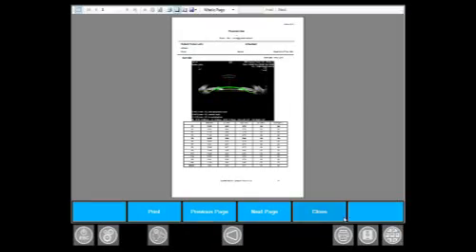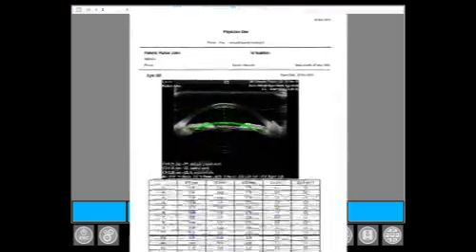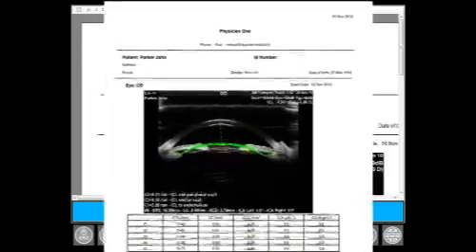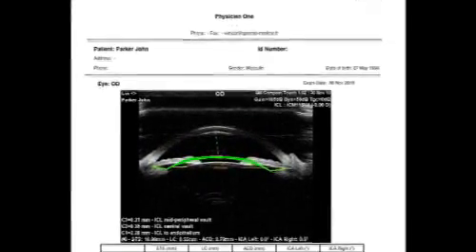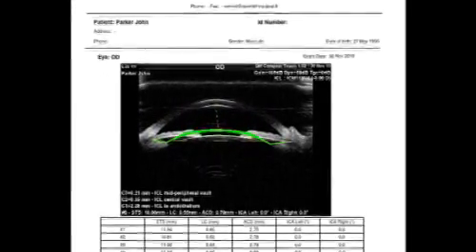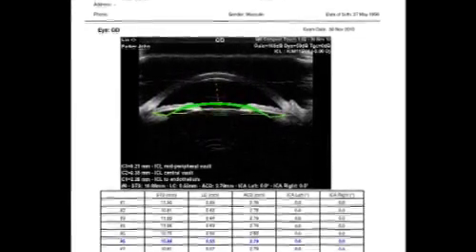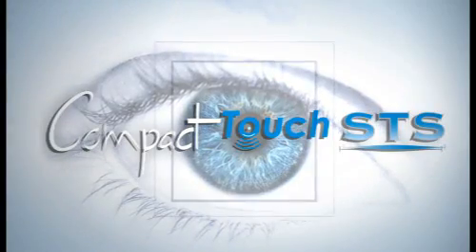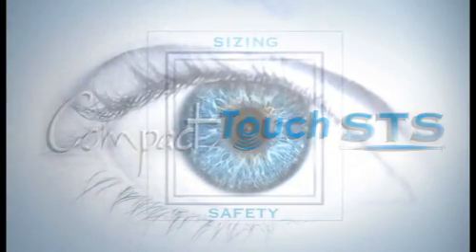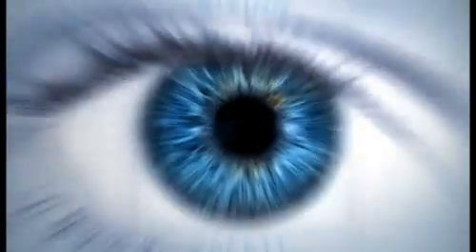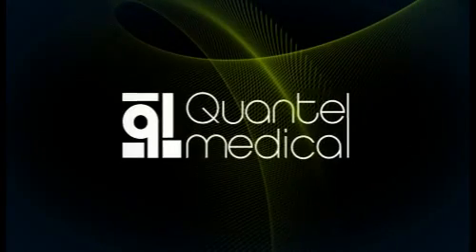All patient examinations are stored in a database and can always be printed out as reports. The Compact Touch STS is the cutting edge ultrasound solution for specialists in refractive surgery.